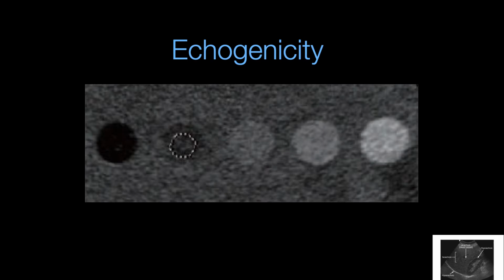So some of the terminology to be familiar with is echogenicity, and basically that's just describing how echoic different structures are. Something that doesn't give off any signal would be anechoic, completely black, and this is typically liquid, like within a vessel or the bladder. Something can be hypoechoic, where it's giving off less signal than the tissue next to it. Something can be isoechoic, like the tissue surrounding this, which is all isoechoic within itself. It's nice and homogeneous.